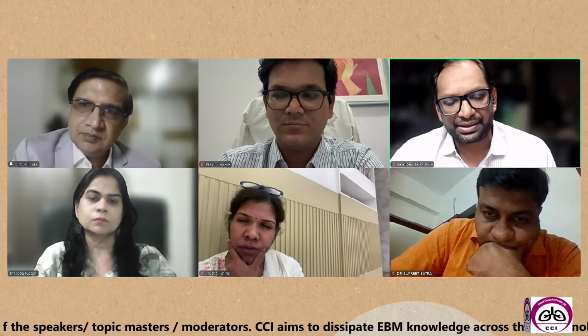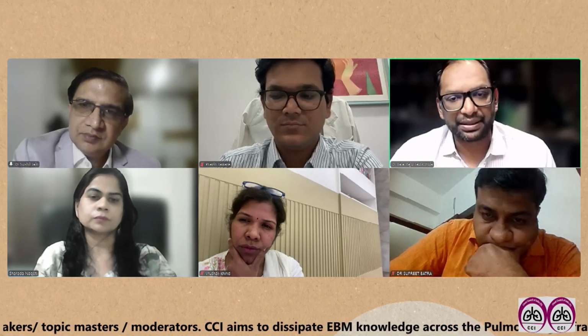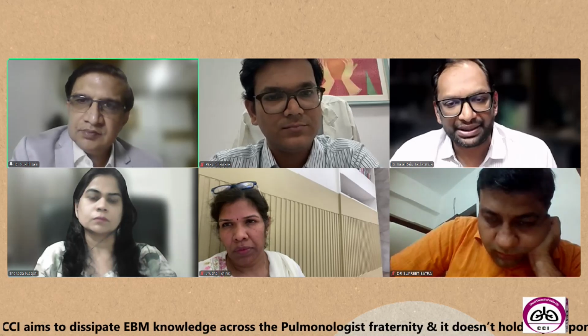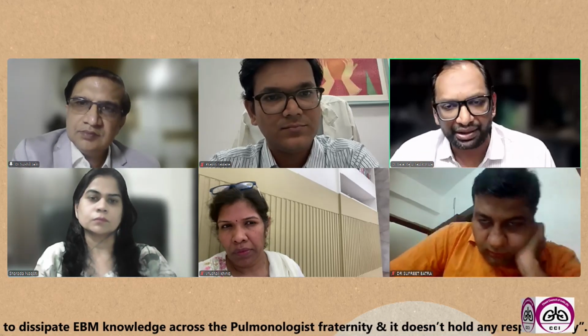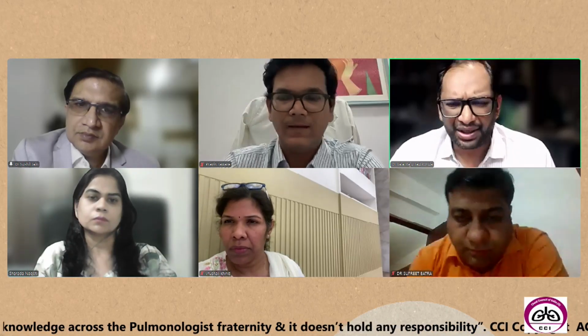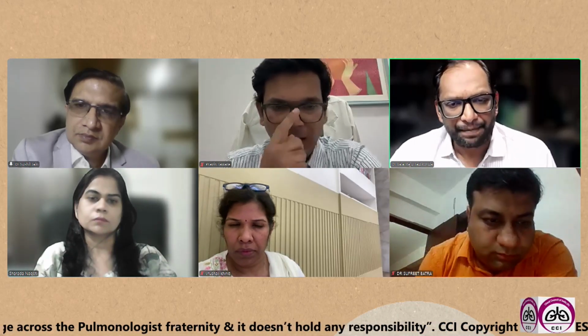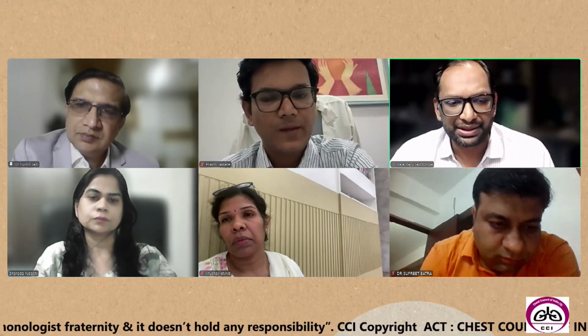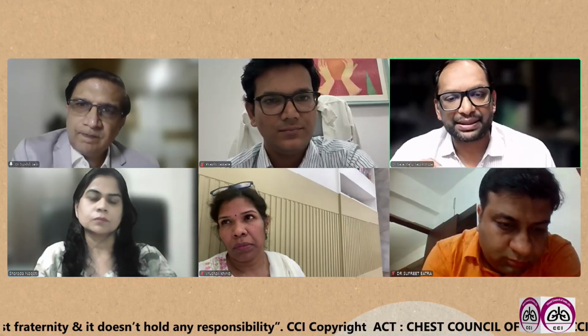What I have seen is the best way to do it is to take the patient under general anesthesia. Most of the time our diagnostic procedures, we do it under conscious sedation, and I still do it under conscious sedation. But what I've seen is that for less than 10 mm nodes, it is very, very difficult to do it under conscious sedation. It is better to do under general anesthesia. You can use temporary paralysis if you want. My point to be noted is these 10 mm lymph nodes are tricky. It is not so easy. And most of the time the sample is inadequate. That's the report you get most of the time.